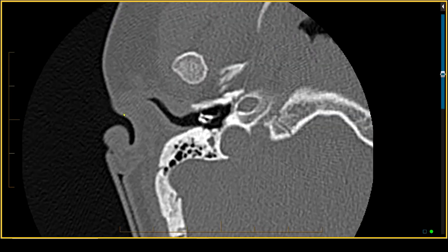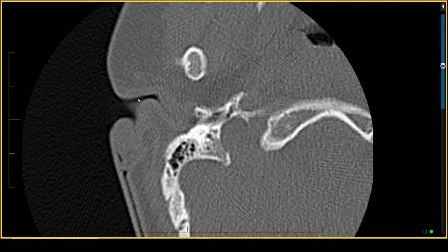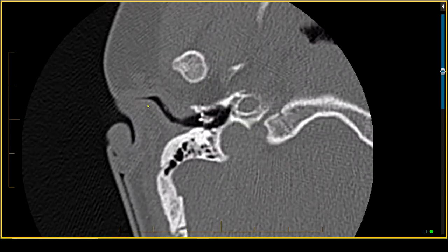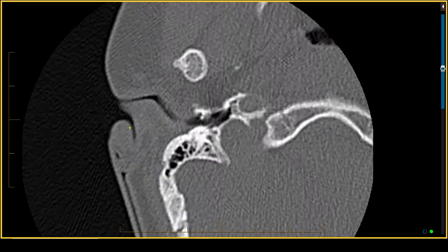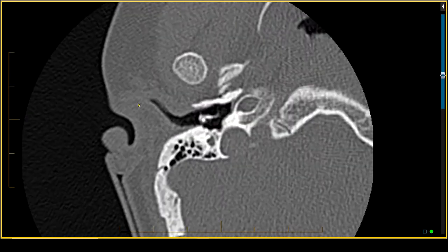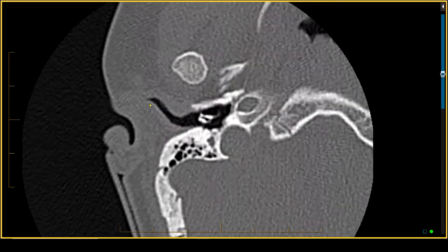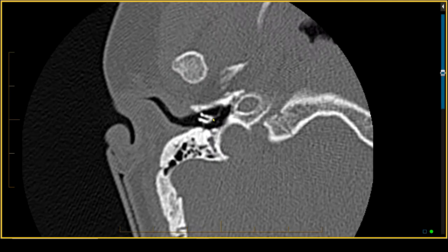Starting with the outer ear, we notice cartilaginous stenosis of the external auditory canal and a somewhat unusual appearance to the helix of the ear. This is an example of external auditory canal stenosis — it's not atretic, but it is stenotic. At the tympanic membrane, which is the border of the external ear laterally from the middle ear medially, we have a myringotomy tube that has been placed because the patient has had problems with chronic otitis media.